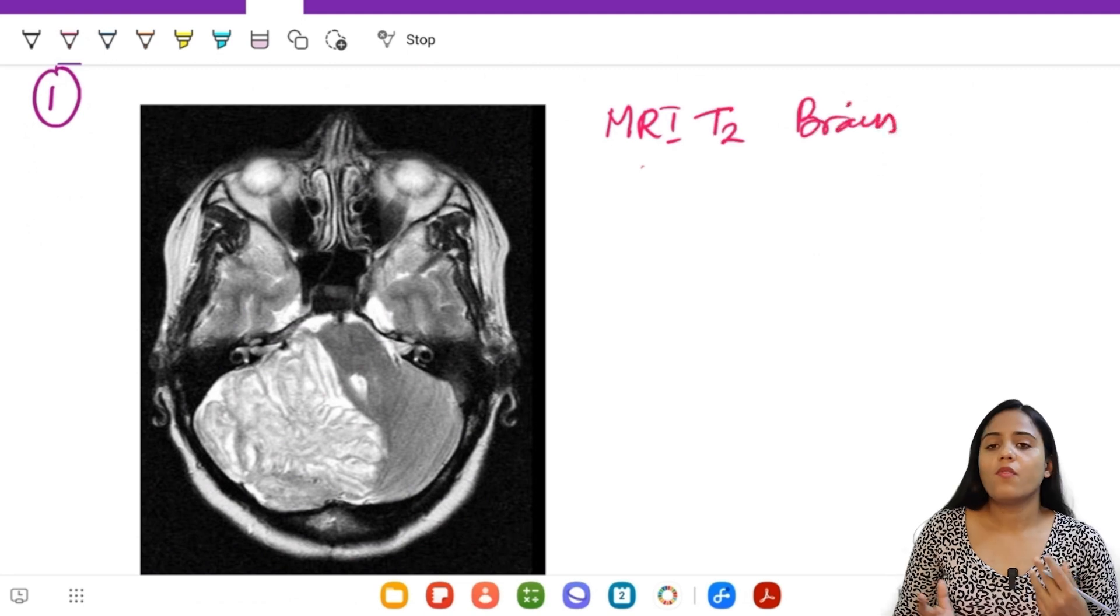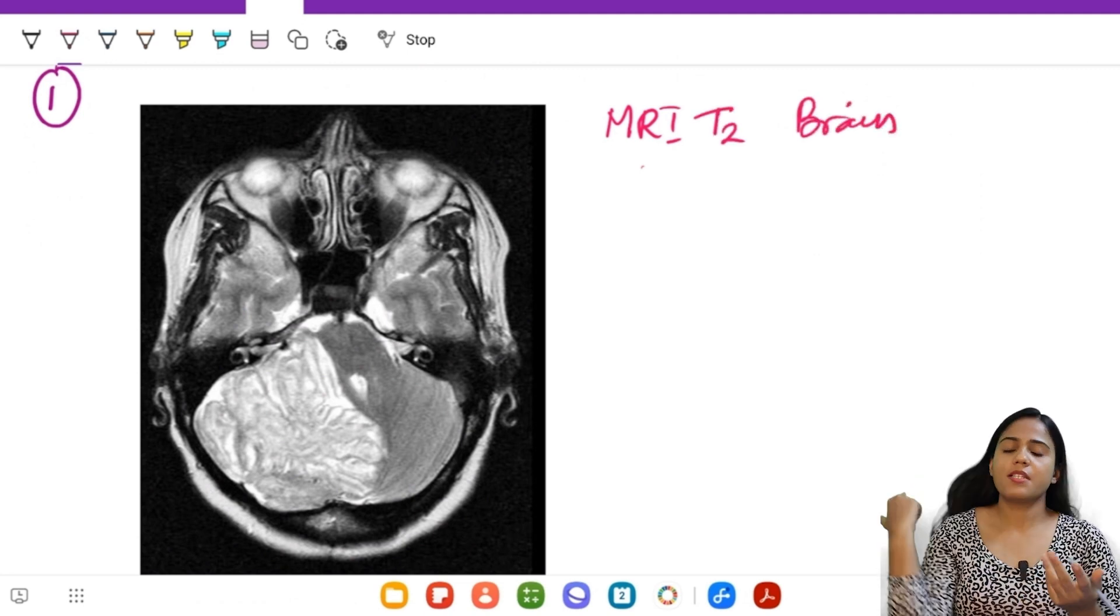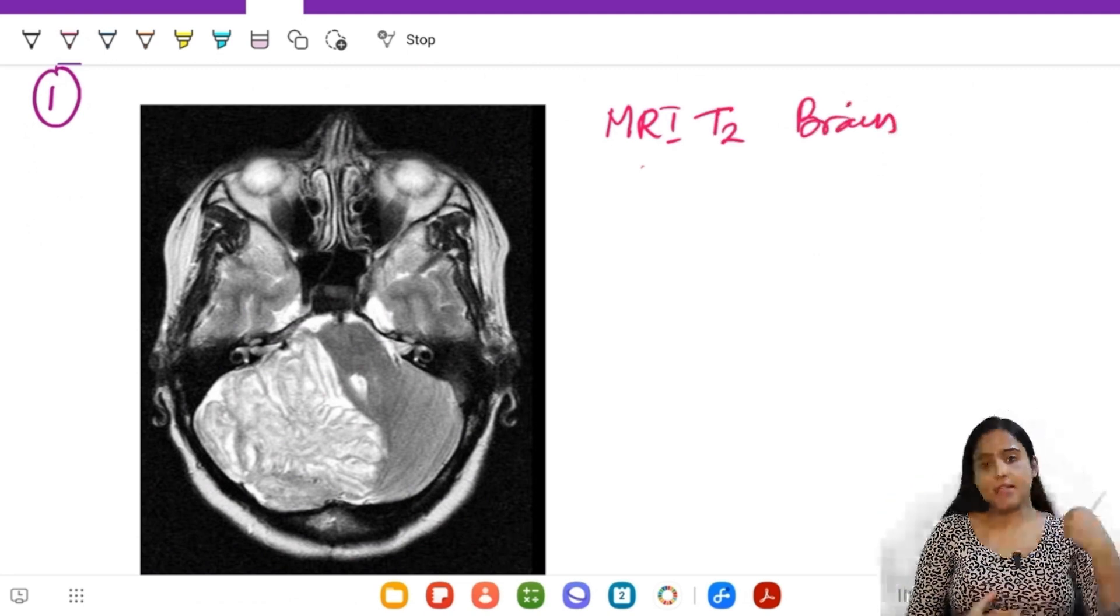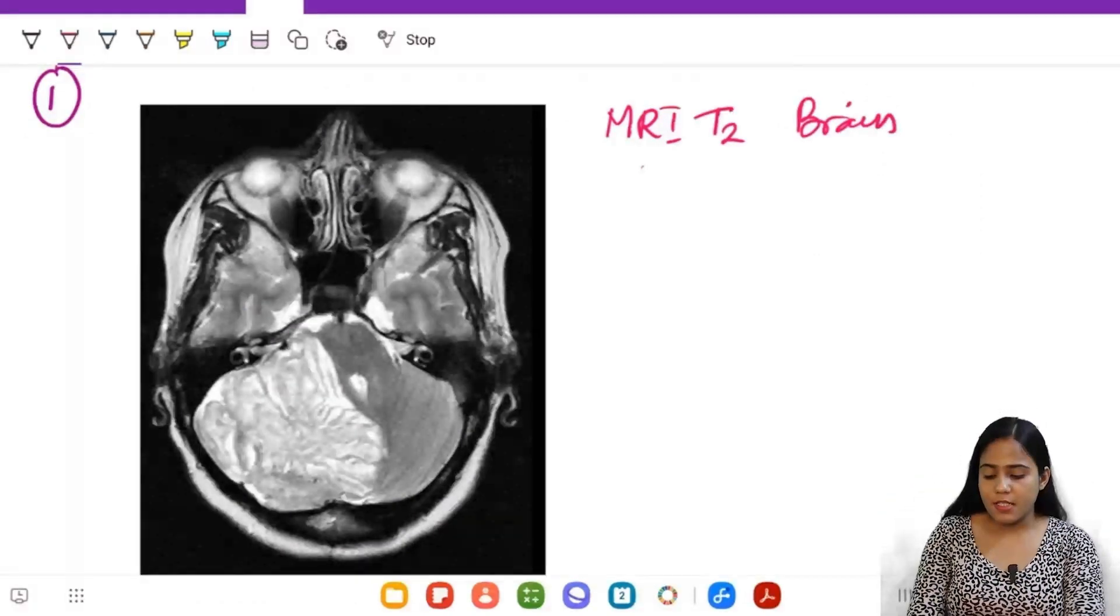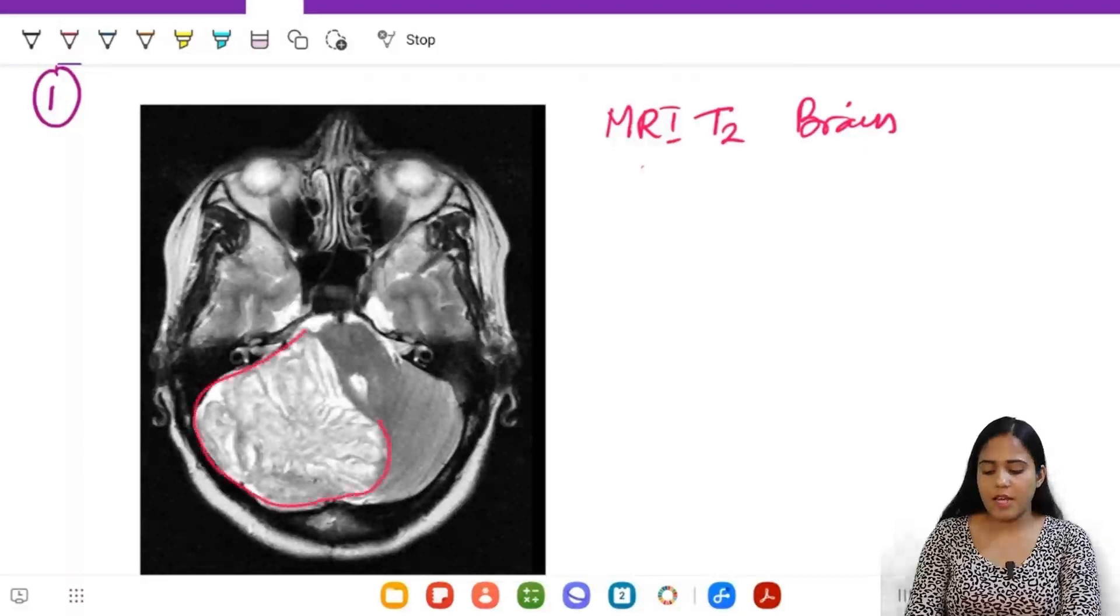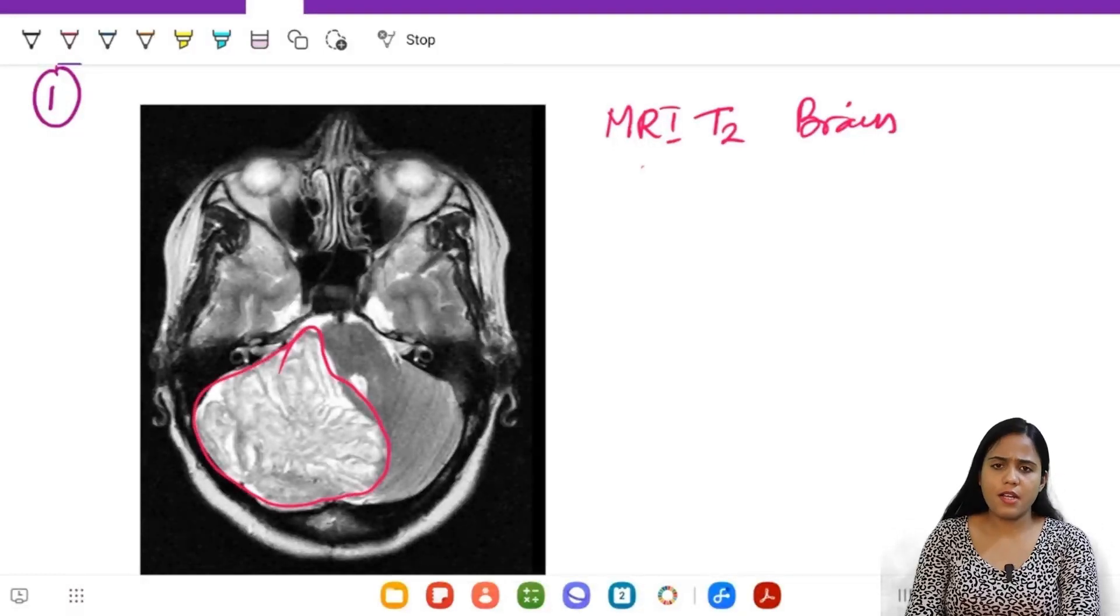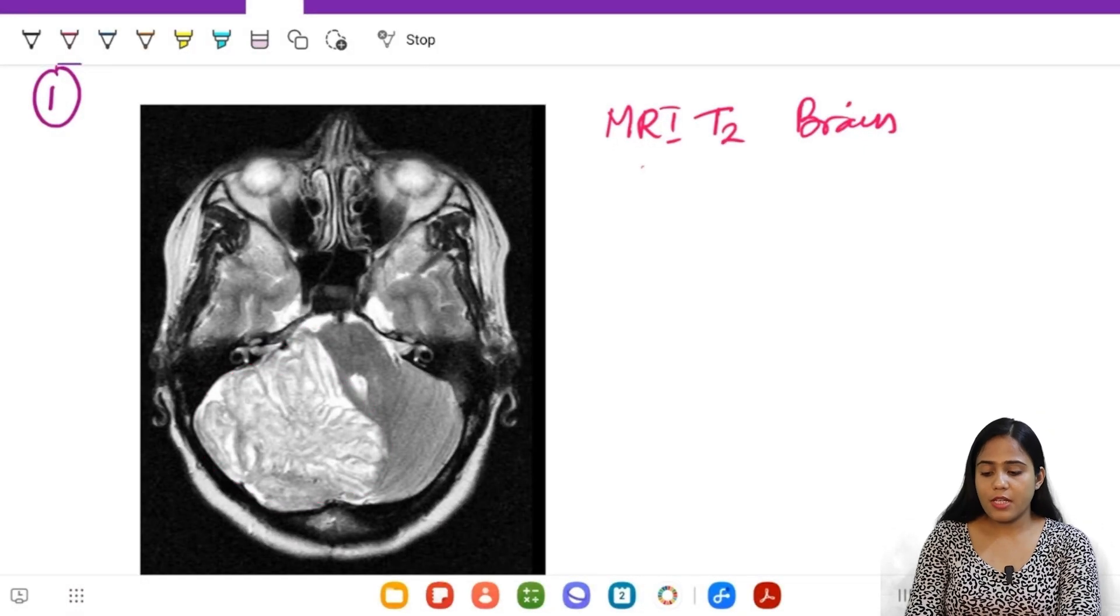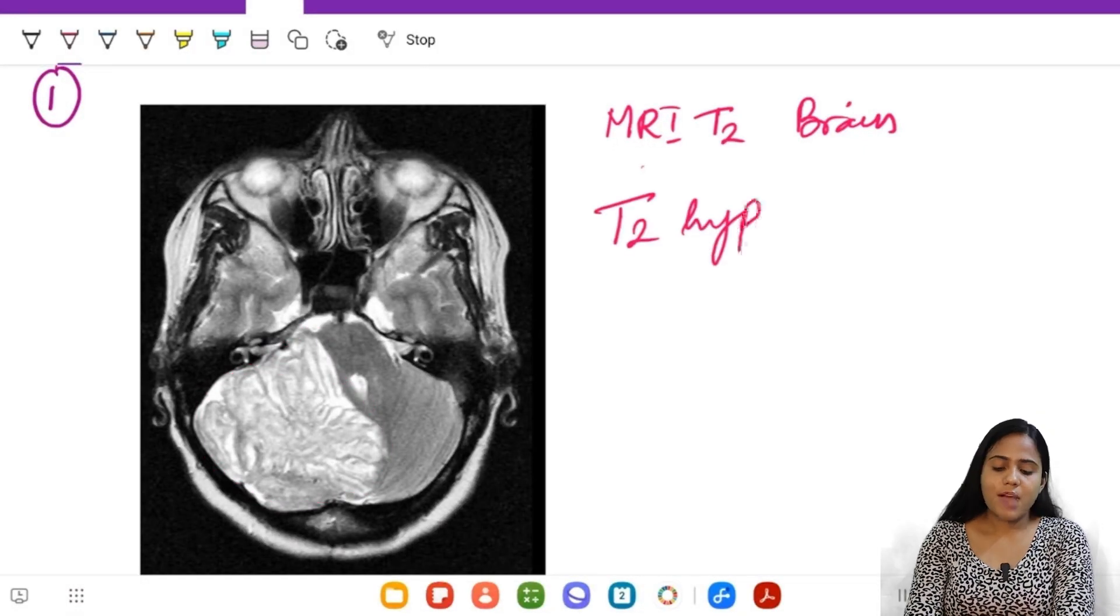What is the abnormality? This very gross abnormality that we can see here is in the right cerebellar hemisphere as well as some part of the vermis is involved. So there is this T2 hyperintense lesion involving the right cerebellar hemisphere.